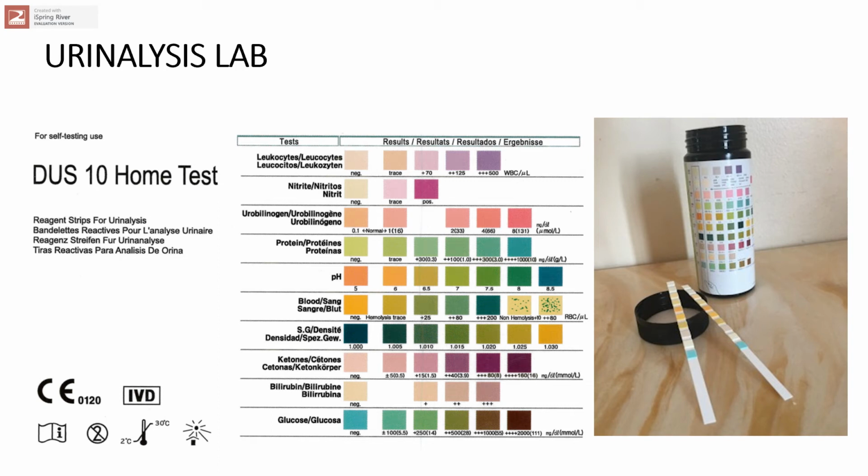So urinalysis is a very simple test. It is a preliminary test performed to check the composition of urine, and some of the findings indicate pathologies. Any change in pH can be caused, for example, either due to the presence of bacteria in the urine, or due to metabolic syndrome, or if you drink too much orange juice, it can still affect the pH, right?